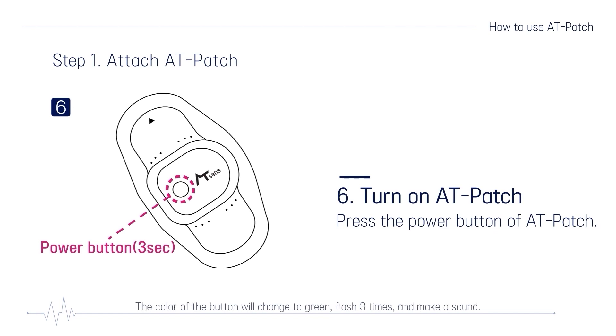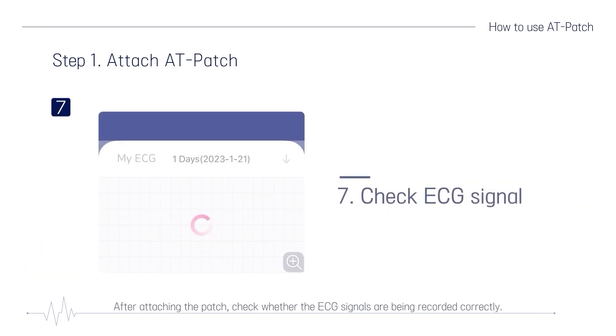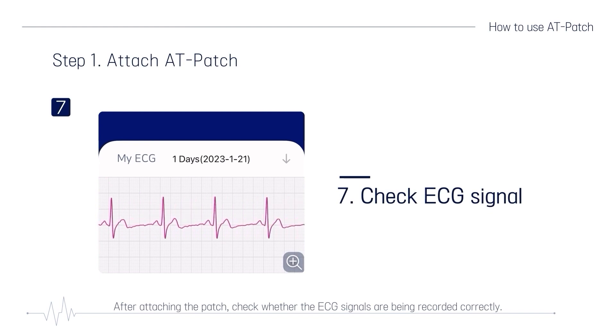The color of the button will change to green, flash three times, and make a sound. Now the patch is powered on. After attaching the patch, check whether the ECG signals are being recorded correctly.